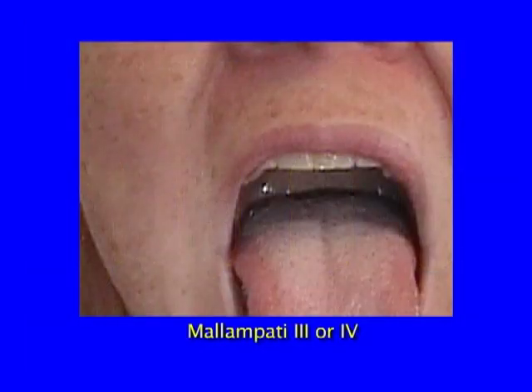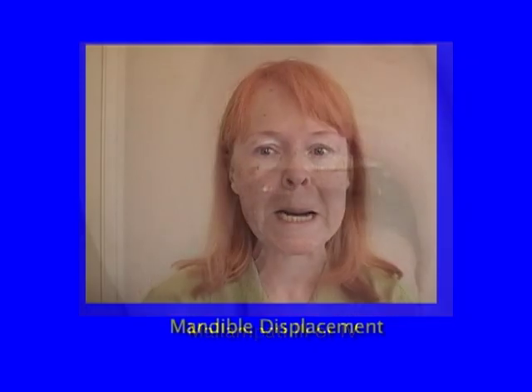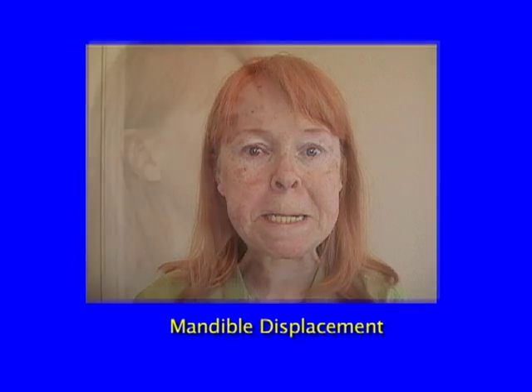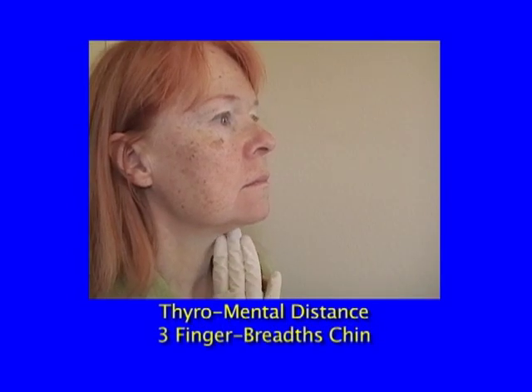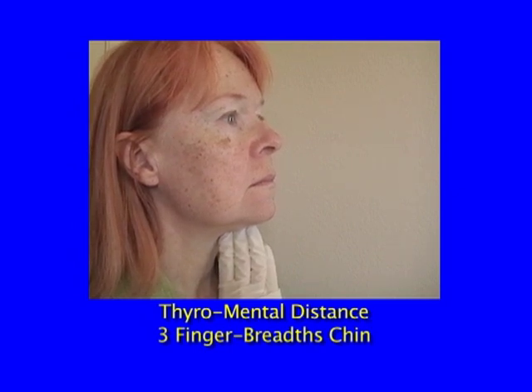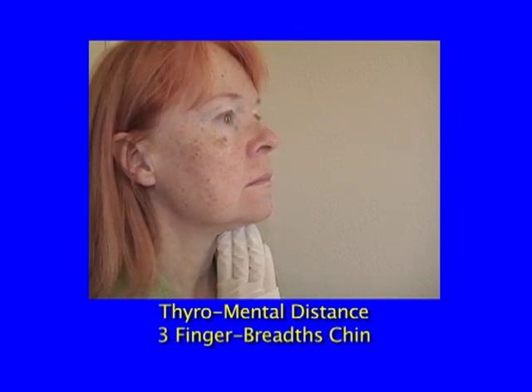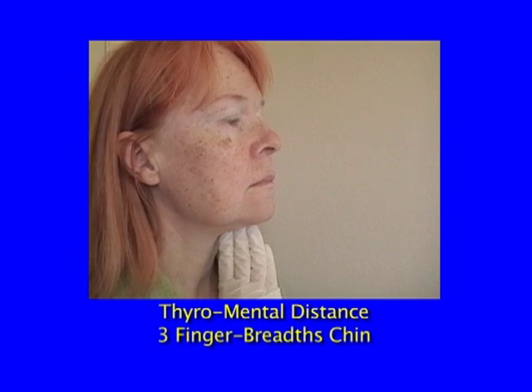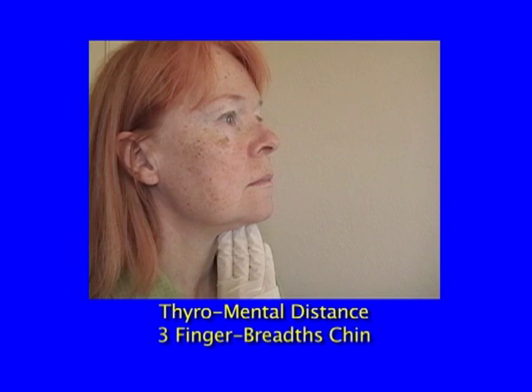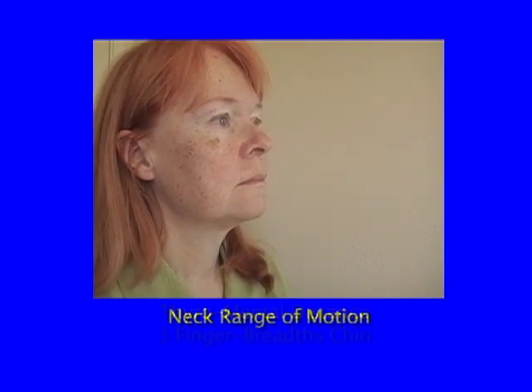Visualization of the larynx can be difficult in these patients because it implies difficulty in displacing the tissue forward with the blade. Have your patient slide their lower jaw over their upper. Inability to do so may make it hard to displace the jaw. If the distance inside the mandible to the hyoid bone is less than 3 fingerbreadths, then the larynx is positioned higher in the neck than average. This can also make intubation more challenging because there is less space to displace the tongue and other tissues forward.